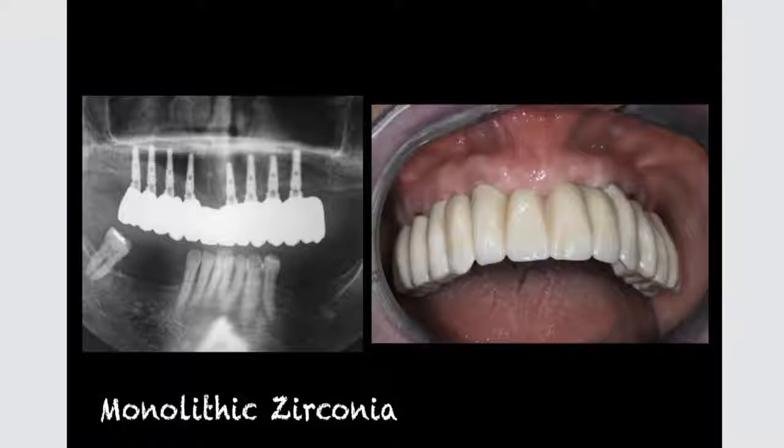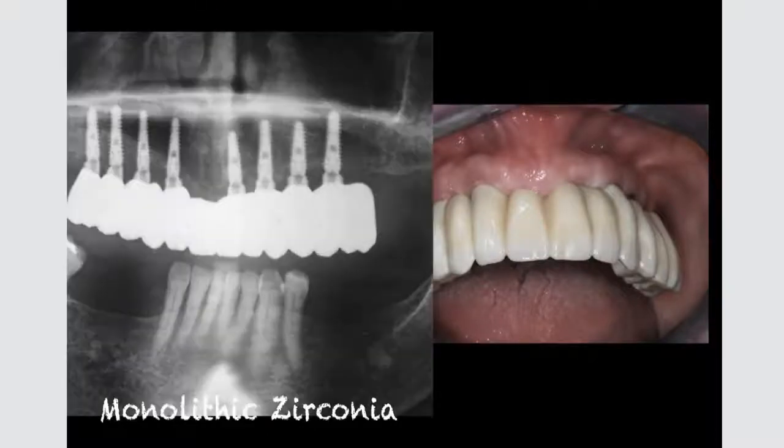Here's the postoperative panoramic radiogram. So as we can see from the postoperative presentation, the implants are parallel, and we have basically almost no cantilever, just a small cantilever on the posterior left side. And the patient was so pleased with that, our next step is to do the lower, of course, and match the occlusion.